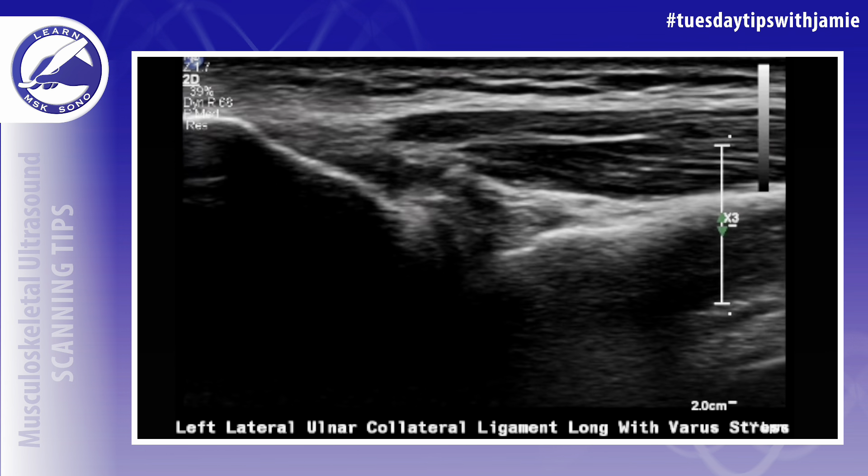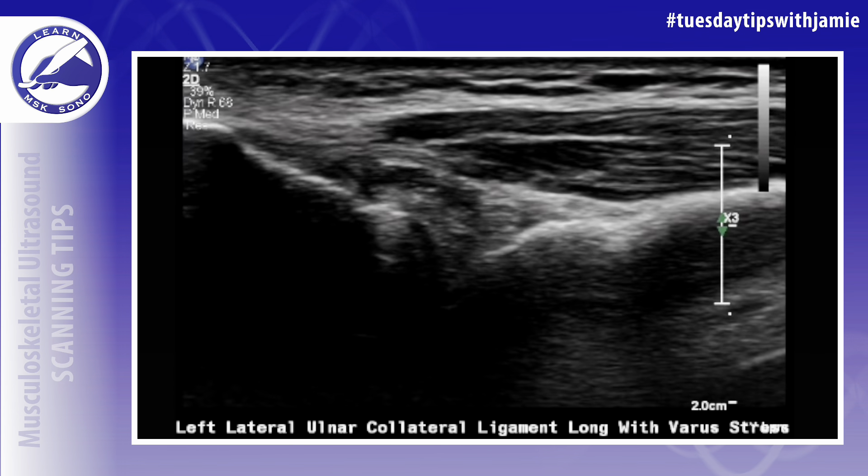This can be done without assistance by extending the patient's arm on the exam table and applying downward pressure to the distal arm during hand supination.